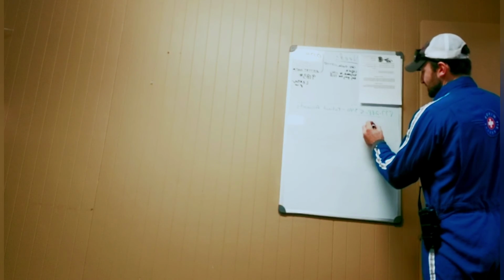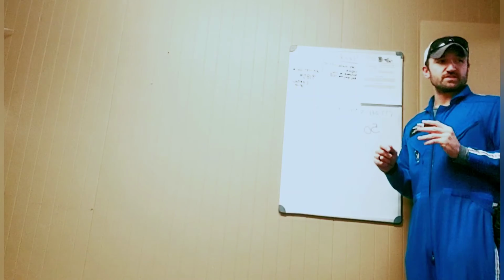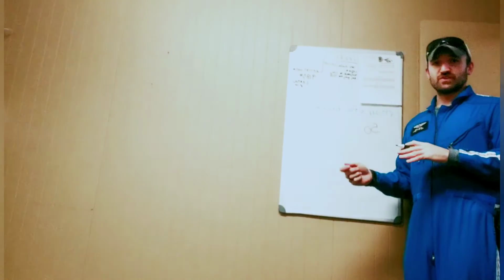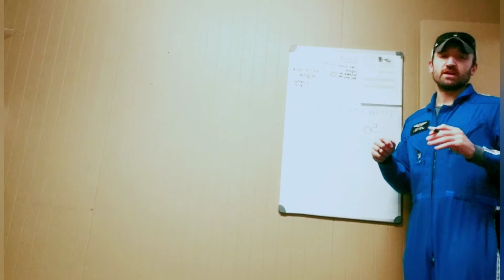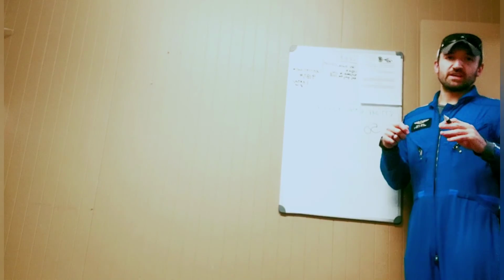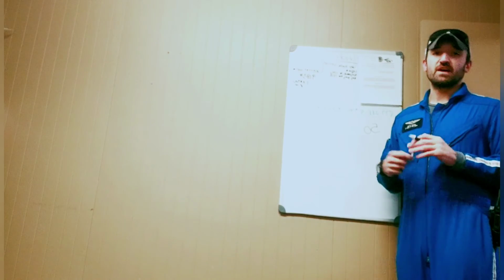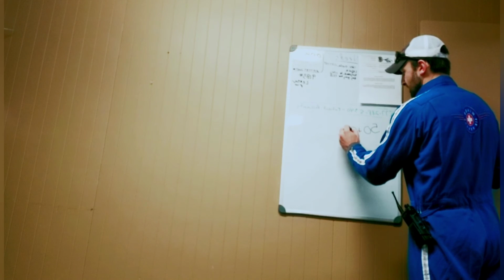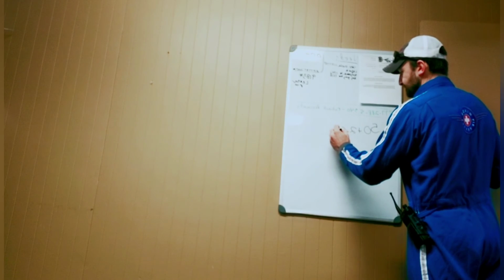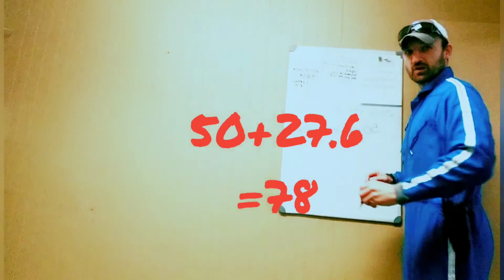We're going to give that patient, for the first 5 feet, 50 kilos. Okay, so that patient's going to get 50 kilos. For that additional 12 inches that's over that 5 feet, they're going to get 2.3 per inch, right? So that's going to be roughly, and I've done the math already here, guys, I don't have a calculator out, I'm not a brainiac at getting this that fast, but it's going to be about 27.6. So we'll add 27.6 to that.